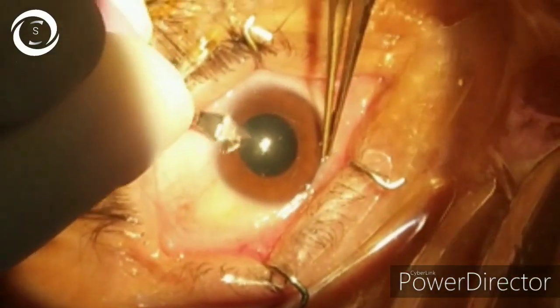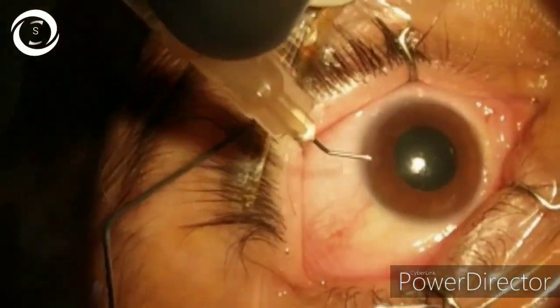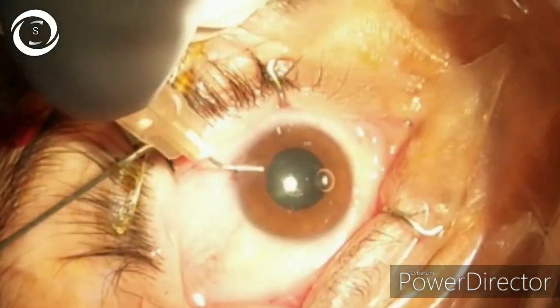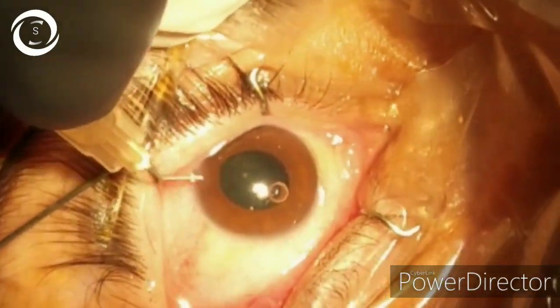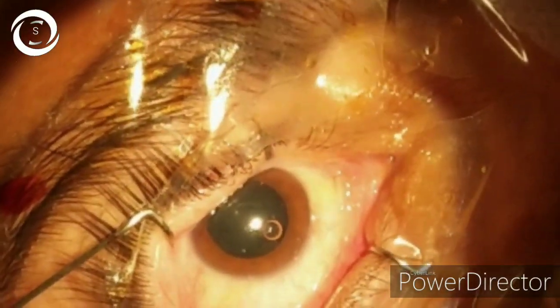As the pupil is not dilating properly, I am using intracameral adrenaline. You can see the pupil is now dilating.